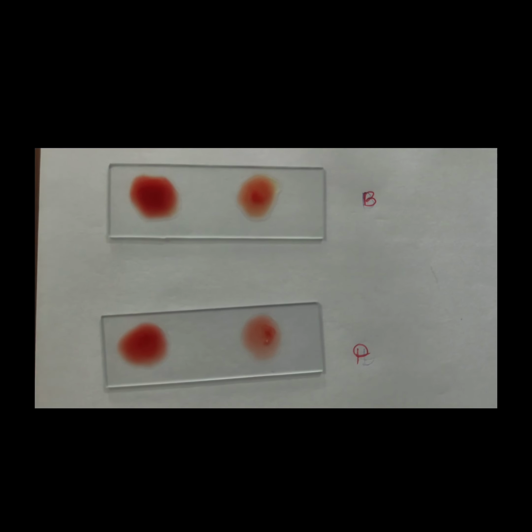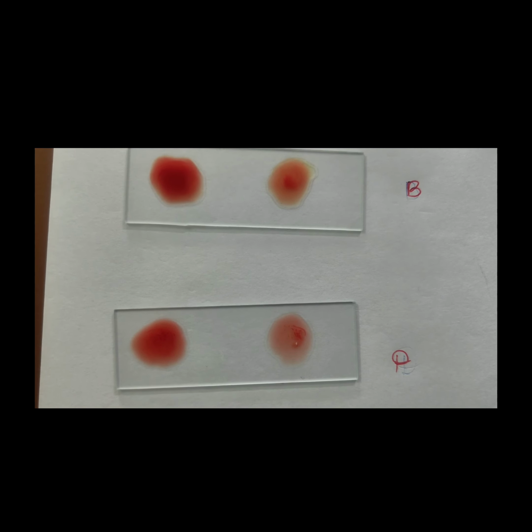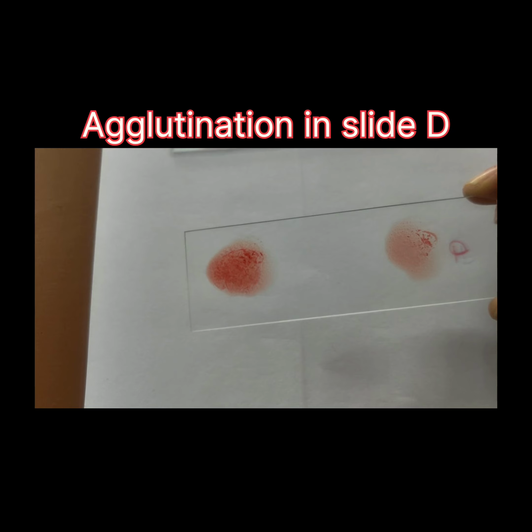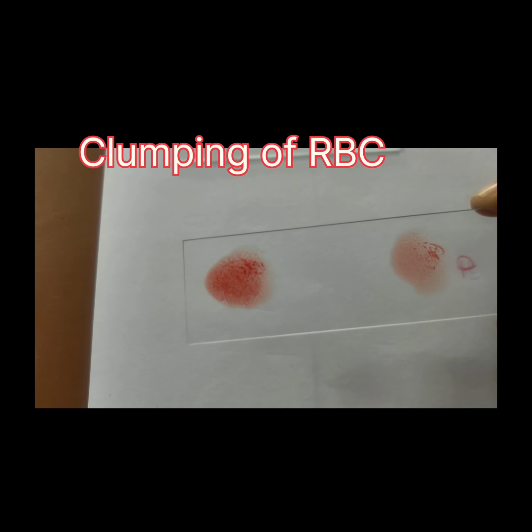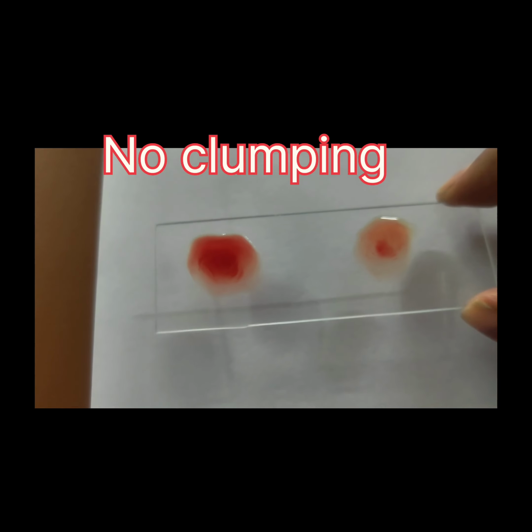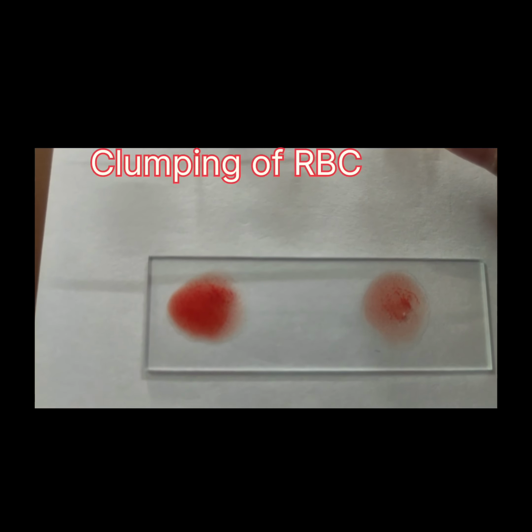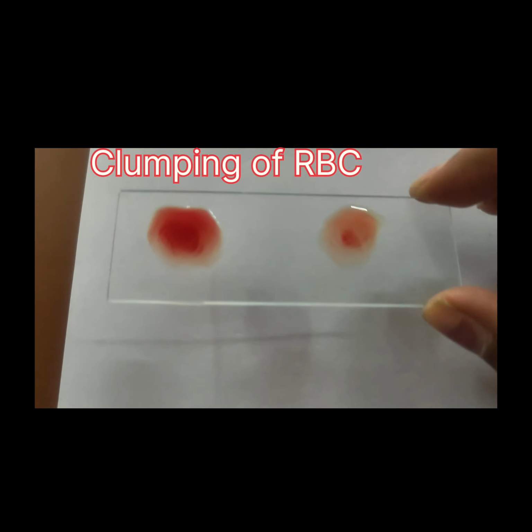In slide D, we can find clumping or agglutination of RBC that can be seen as a very fine dot-like structure in the slide. If you are getting confused with the agglutination, you can compare with its negative slide. So our result is O positive blood group, because there was no agglutination in slide A and B, while agglutination was only present in slide D.